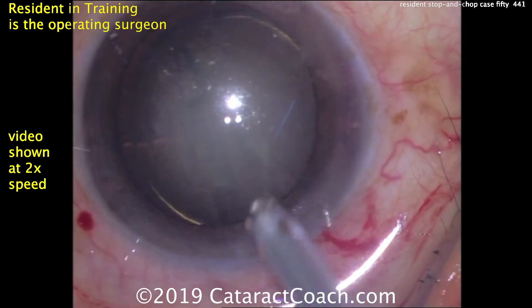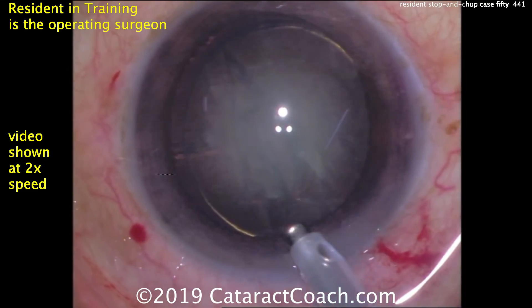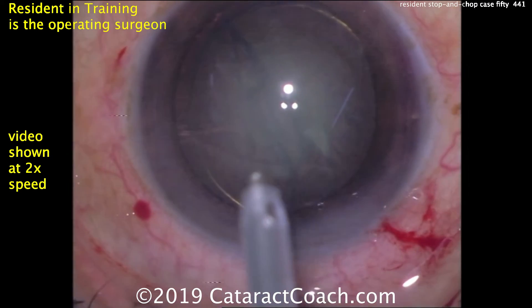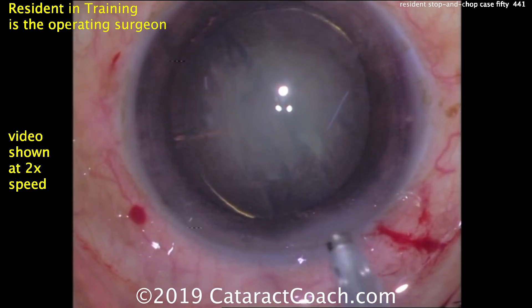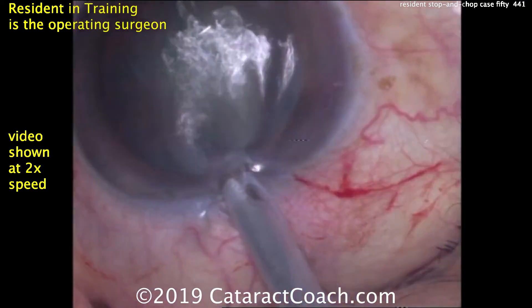We don't know the phaco settings of course, and in fact we don't even know which country this resident is from. This is a totally anonymous submission to our website. You too can submit your video at CataractCoach.com — just follow the instructions. You can send a video with your name on it or totally anonymous.